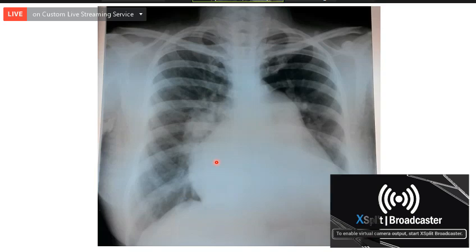When a patient has pulmonary plethora, you have to find out whether it is a left to right shunt at the atrial level, at the ventricular level, or at the level of the pulmonary artery. So it is ASD, VSD, or PDA. How will you differentiate between them? In ASD, which chamber can be dilated that will not be dilated in VSD and PDA? RA. The RA will be enlarged in ASD, but not in VSD or PDA.